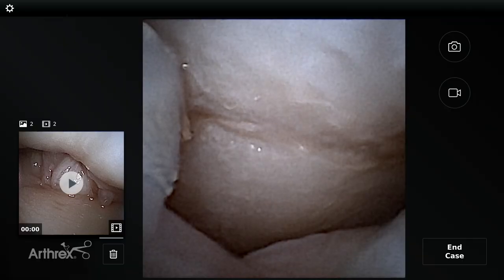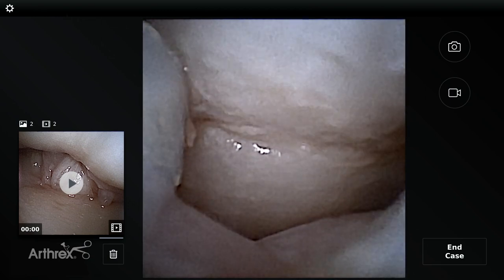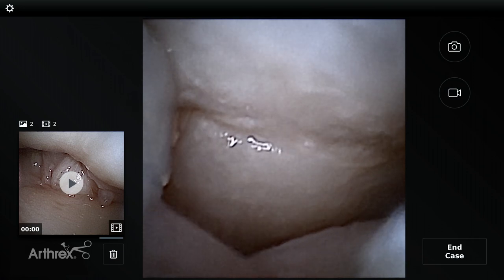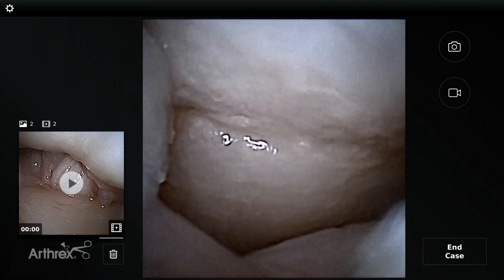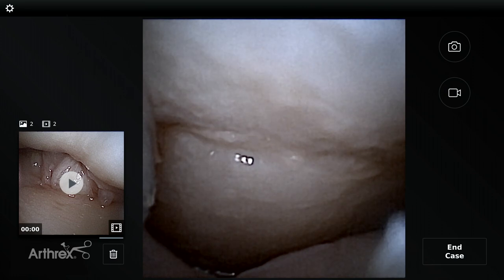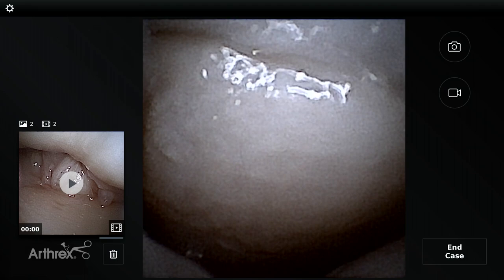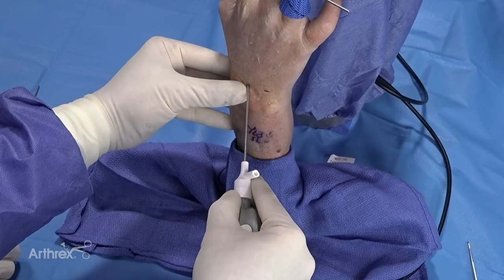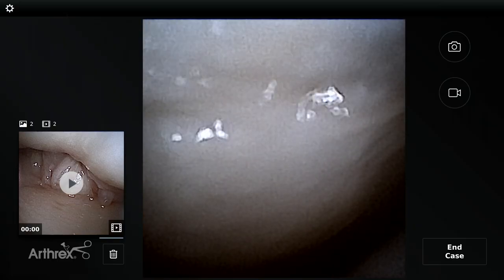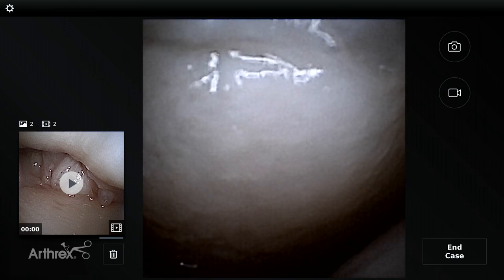One of the real advantages of the nanoscope is that it allows us to get into tight spaces. We saw that on the ulnar midcarpal joint earlier. Now I've followed the scaphoid, and with traditional arthroscopy — a 2.7-millimeter, 30-degree scope — it doesn't really bend or contour. We've gone around the scaphoid without causing cartilage injury, and now we're in the STT joint. We see the trapezoid towards us, and palmarly you can see the trapezium. You can see how we're in a tiny space — no more than a couple of millimeters.